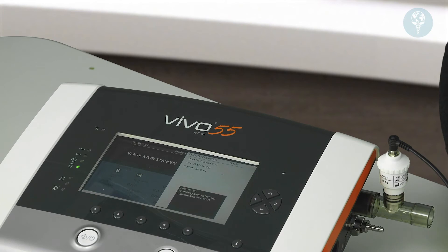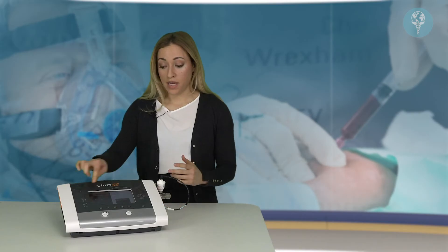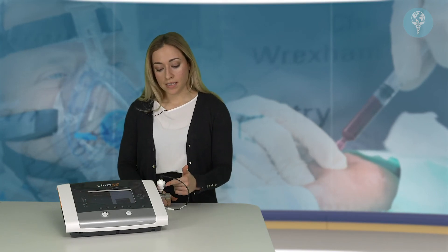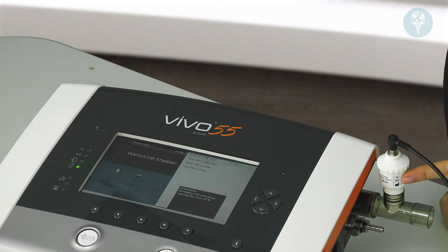Once the FiO2 sensor has been set up and is ready to use, it will tell you the fraction of inspired oxygen on the screen when the ventilator is running. The sensor module on the side will need changing roughly every six months.